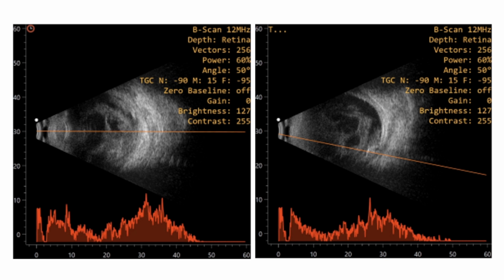It's probably an IOFB. So can anybody explain why it was not seen in this scan, while it is seen well in that scan? Ma'am, probably it was just perpendicular to it, and therefore the high reflective echo was picked up. Yeah, a perpendicular scan will show it better. So this is very important. In any case where you suspect a foreign body, even otherwise any endophthalmitis, especially post-traumatic, you have to do a proper scan to look for a foreign body.